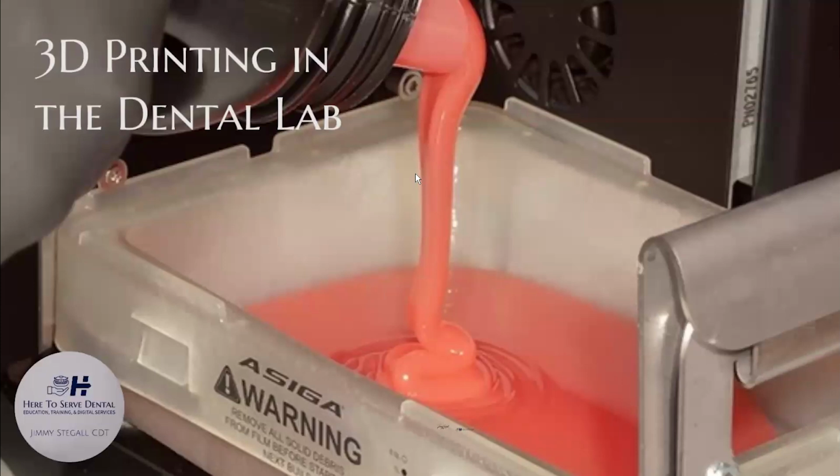The other thing you want to look at is that most CAM software that runs these printers has the ability to print a layer of resin first before it starts printing the supports and the parts. If you add that layer at about 2/10 or 3/10 thickness, and you make it solid instead of mesh, that will also enhance that, keeping everything connected well and not distorting.